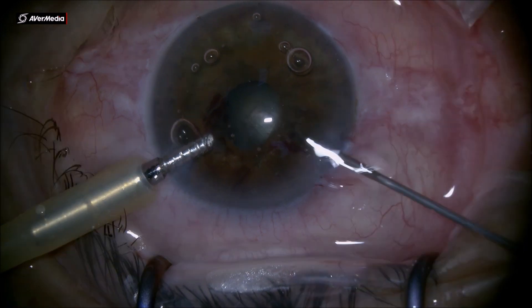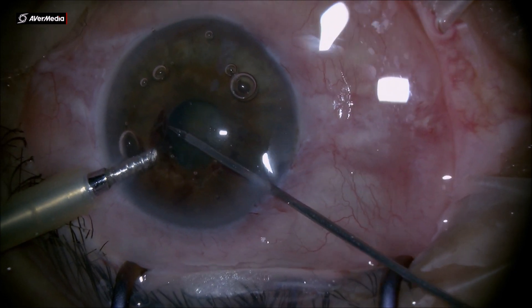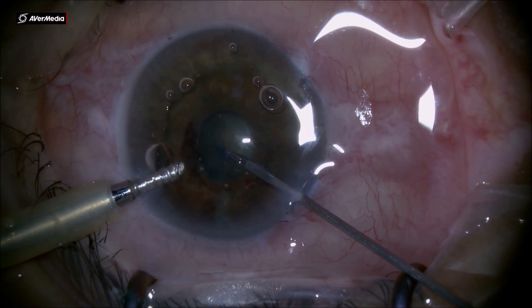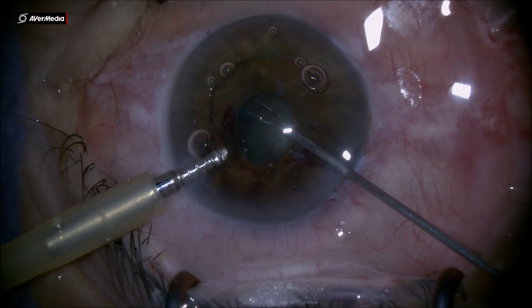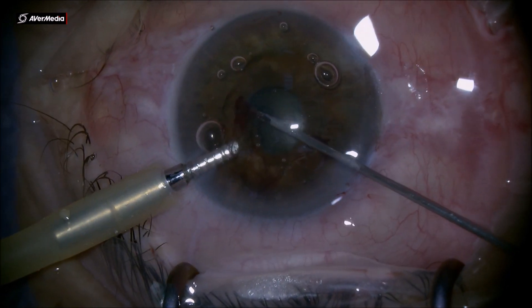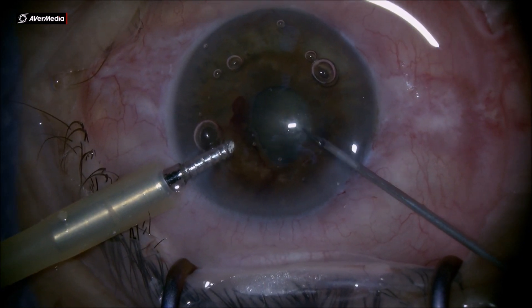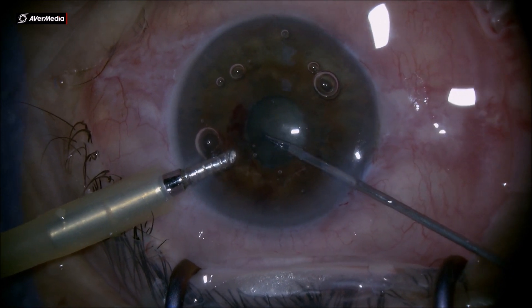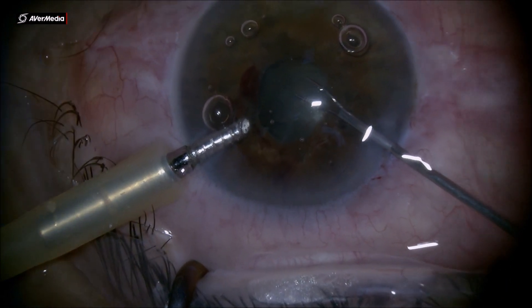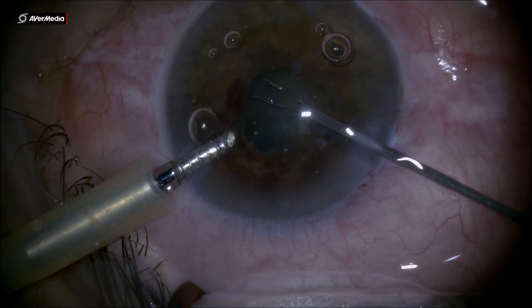Having a capsulorrhexis with such a small pupil, the capsulorrhexis has to be done underneath the iris, underneath the pupil, so you need a really good forceps to maneuver that anterior capsule. These cross-action forceps have a jaw that makes contact with the anterior capsule, and with a couple more attempts you can do a very nice round capsulorrhexis underneath the pupil.